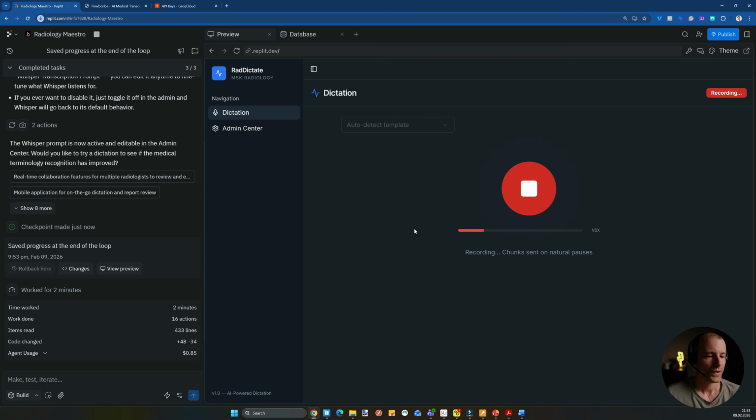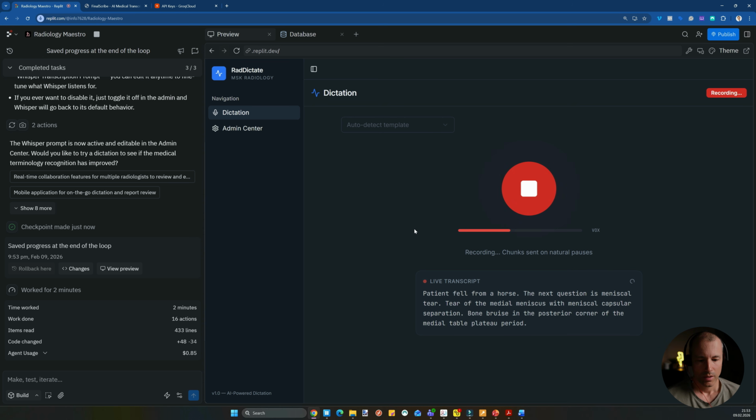Patient fell from a horse. The question is meniscal tear. I can see a complex tear of the medial meniscus with meniscocapsular separation, bone bruise in the posterior corner of the medial tibial plateau, period. The MCL is partially torn at the femoral attachment, ACL completely torn, lateral meniscus intact, large joint effusion. Typical bone contusions after a pivot shift injury, period.